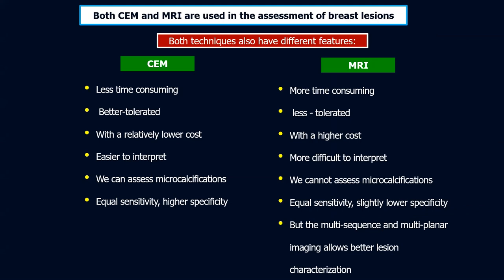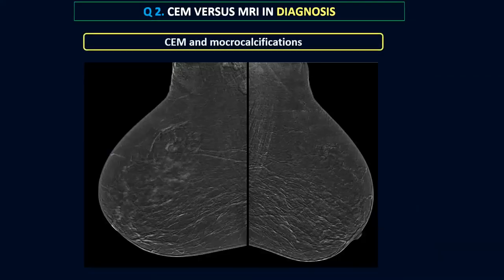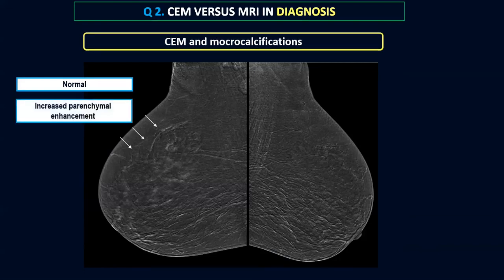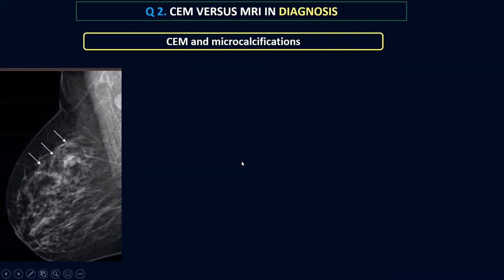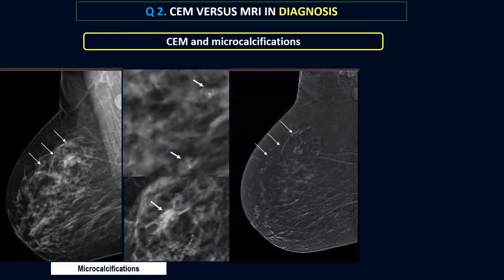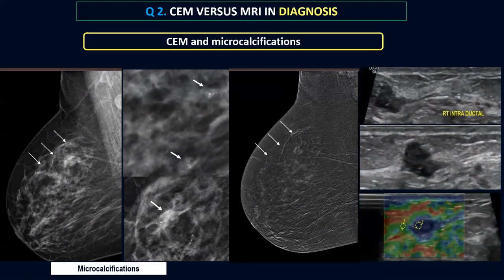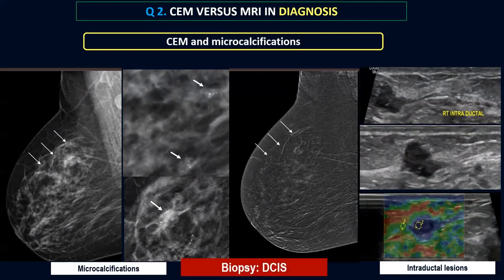Going back to the comparative table, a very important advantage of contrast mammography over MRI is its ability to see microcalcifications on the low energy image. In this case, starting from the contrast study, most would say it is near normal or note very subtle enhancement in the right breast — possibly parenchymal enhancement. But going back to the mammogram of the same patient, we find microcalcifications taking the same distribution as the subtle enhancement. Without the low energy images and the calcifications, we would never have diagnosed a DCIS in this patient. Biopsy confirmed underlying DCIS.